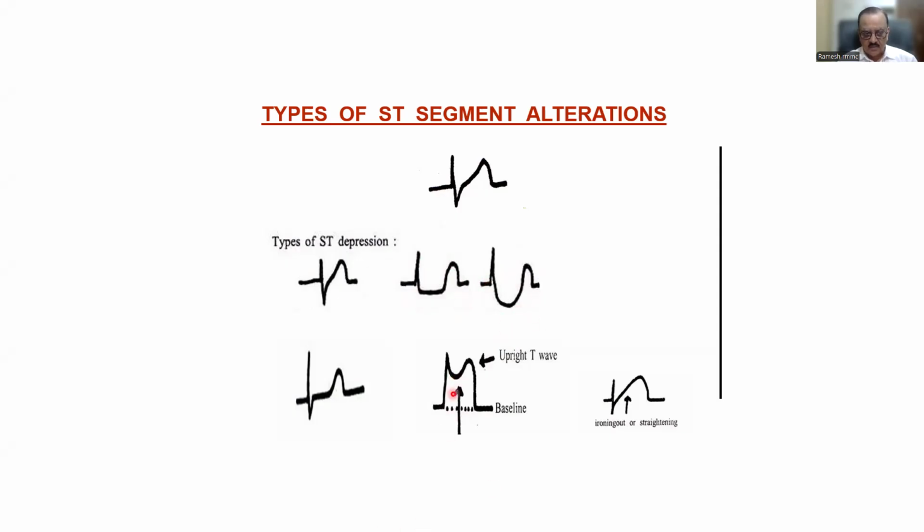See this ST segment. Do you think this ST segment is normal or abnormal? See, grossly elevated, concavity, upright, everything is there. That's not the matter. But elevation from the baseline, more than 2 small squares, is a pathology. He has to be admitted. It is an emergency. He may die within 1 hour. This is an acute event.